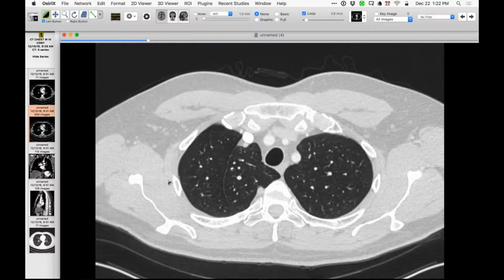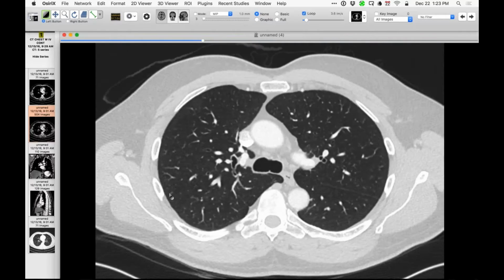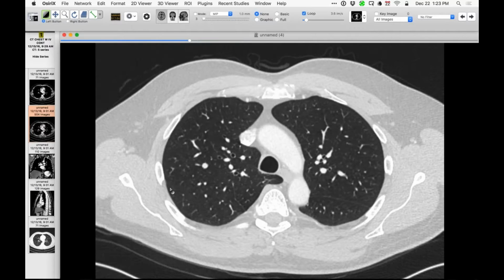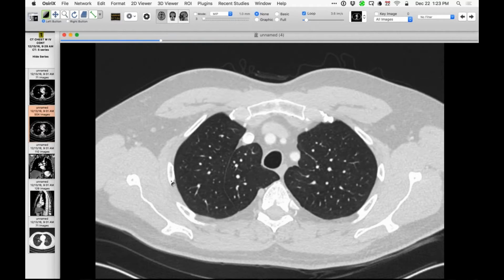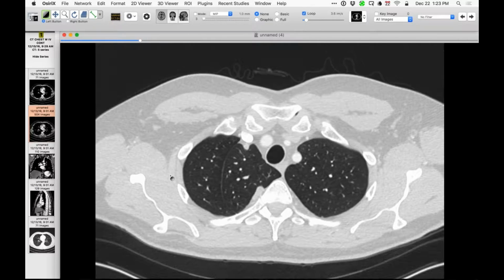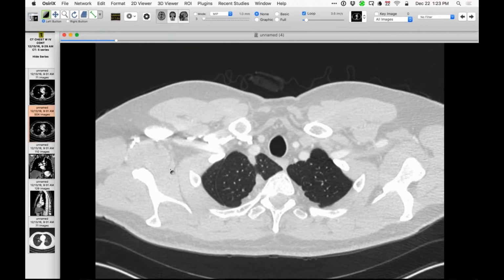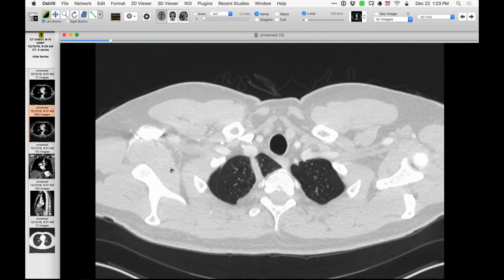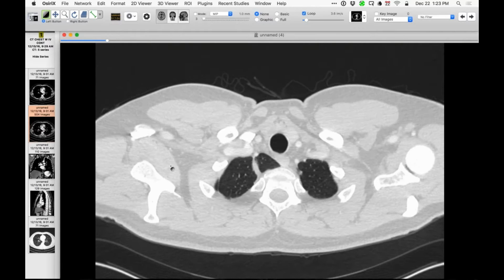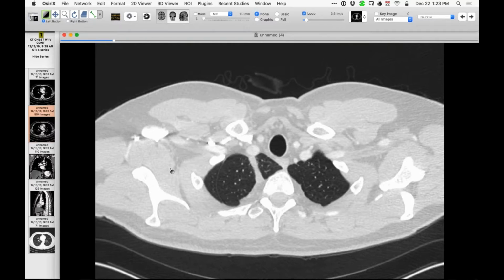Was there an azygos vein arch farther down at the usual level? No, nothing over here, right? So could this be an escaped azygos vein? It's been described in patients with azygos fissures where the vein pops out at the fissure because it's not truly in the lung. I've seen a couple cases following surgery where they drop the lung, and there's a few descriptions of it in the literature. I think we've shown a couple, or I know I've shown one. Yeah, you've shown a couple. I've seen them now that you've mentioned them too.